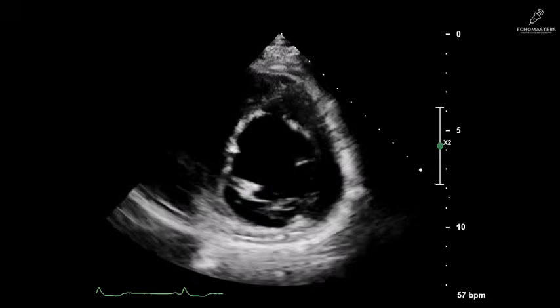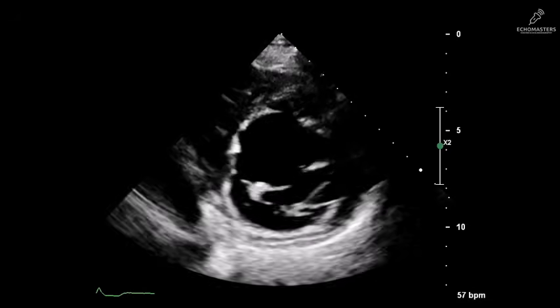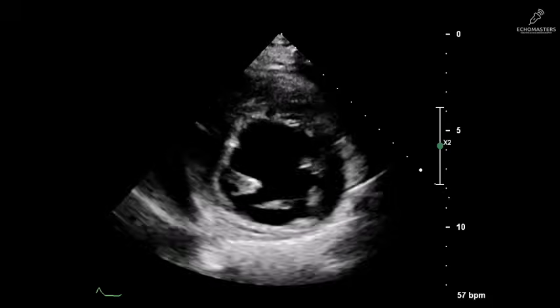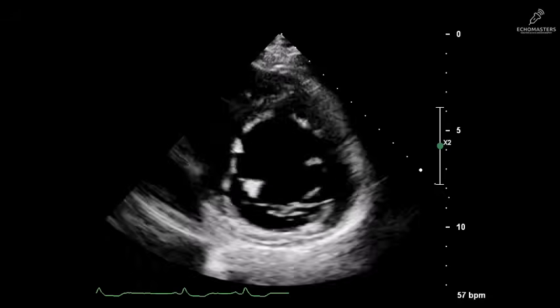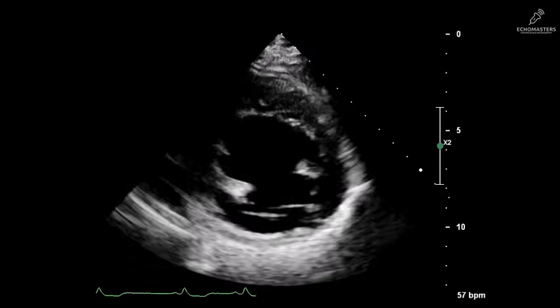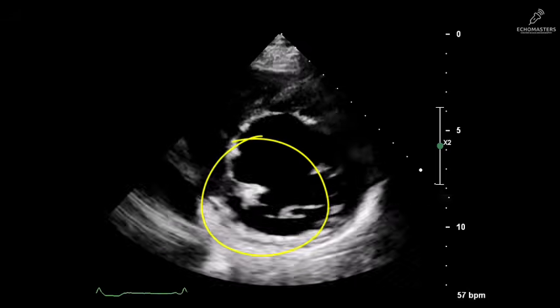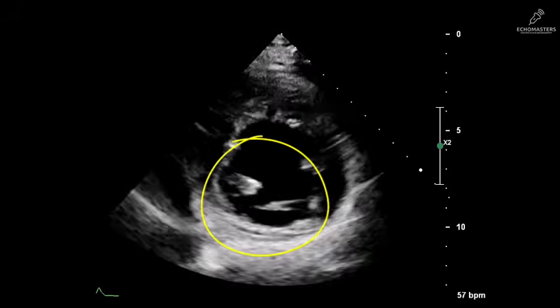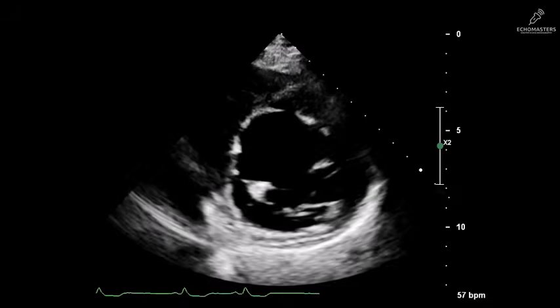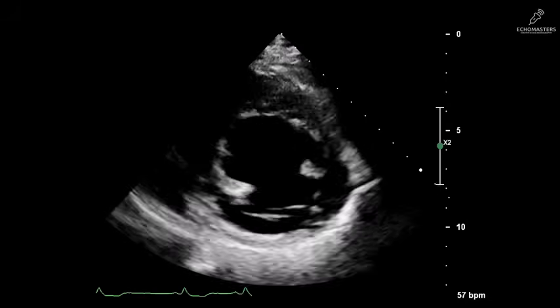When you tilt down to the mitral valve level, you can see that the mitral valve has a normal structure. There is not much concern about the mitral valve in this case. But again, you can see clearly that there are marked regional wall motion abnormalities. You see a striking abnormality here, almost akinesis, with some brightness, likely scarring in the inferior walls. This is the RCA territory. The other walls aren't moving well either, and there is some dyssynchrony.